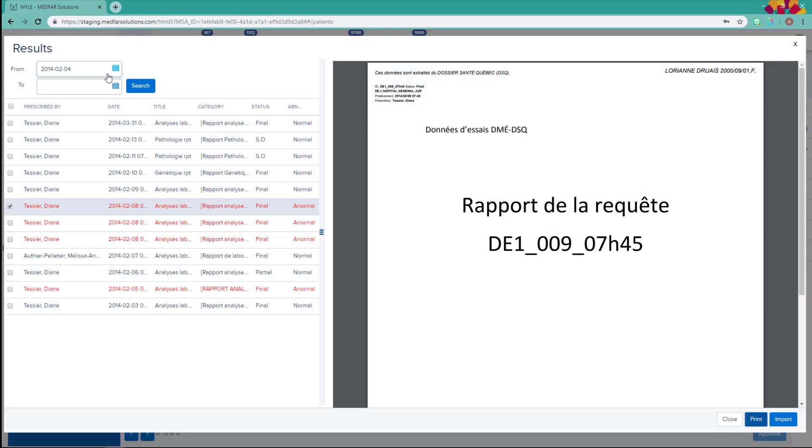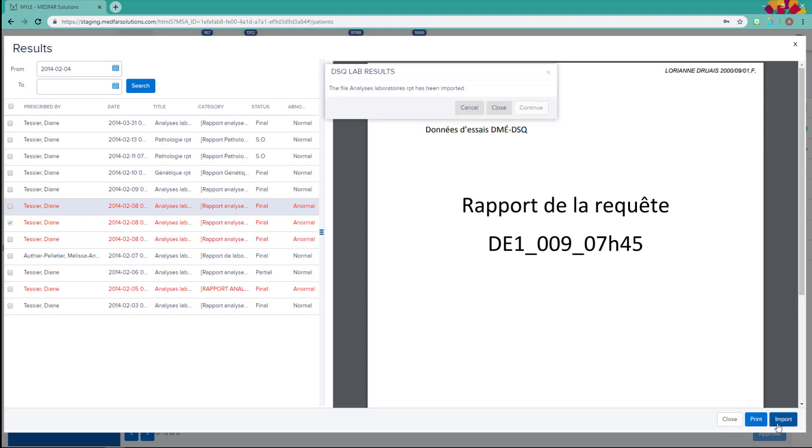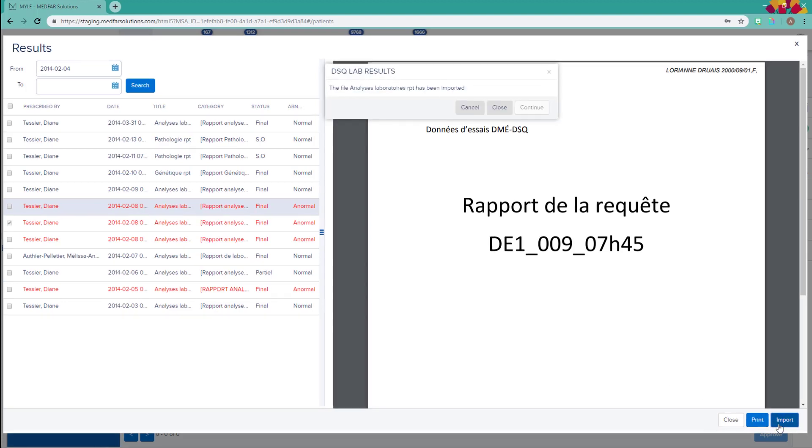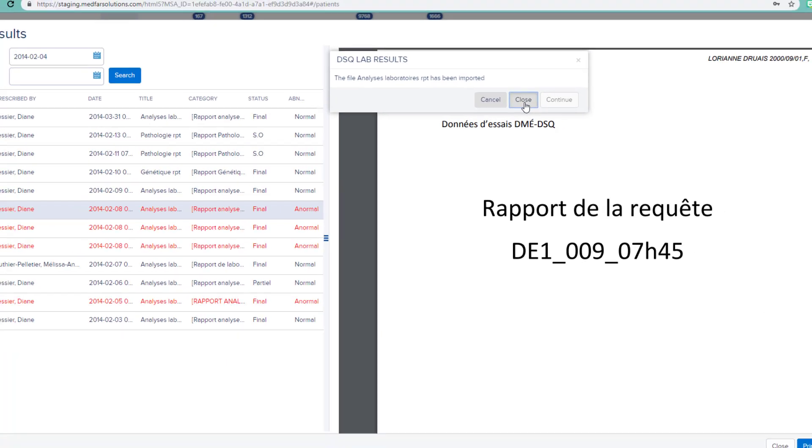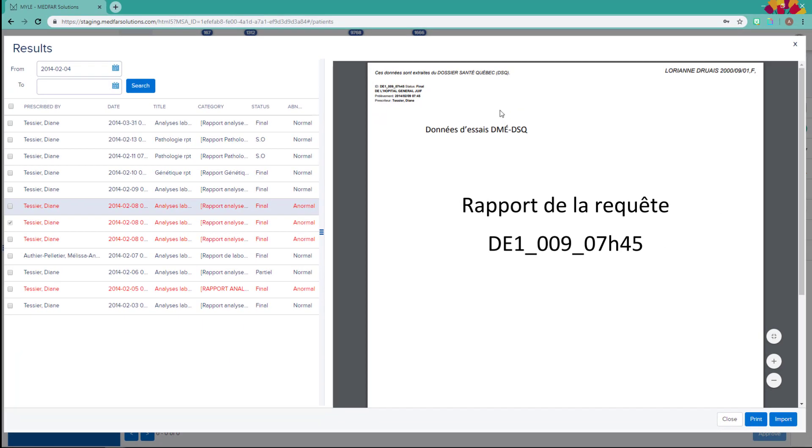To import a document, select the corresponding checkbox, then click Import. Once the document is imported, click here. To return to the patient's documents, close the window.